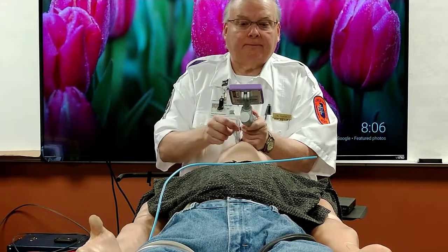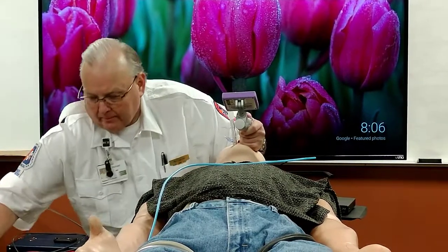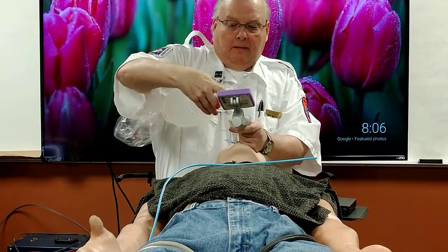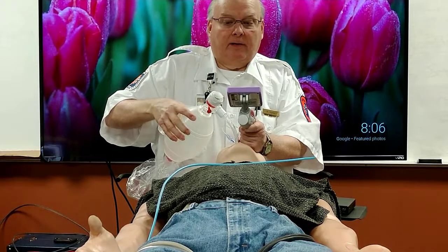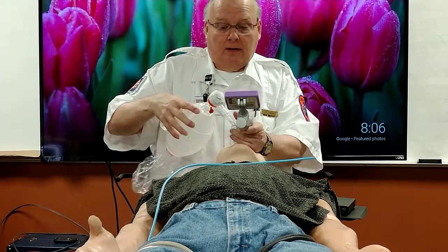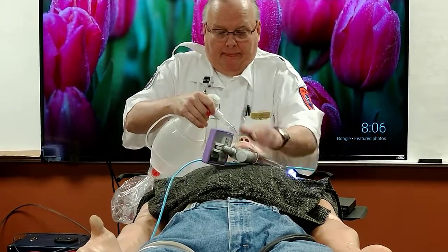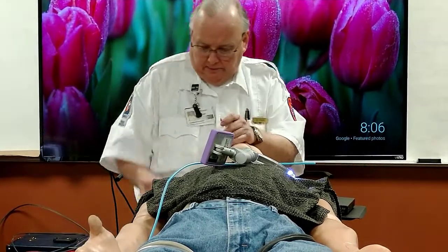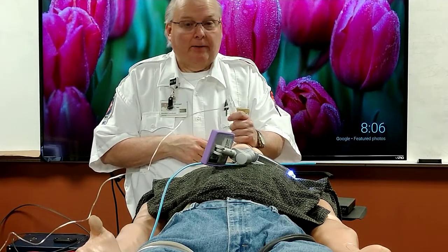Inflate the cuff, secure my tube, attach my bag mask, ventilate through that, checking lung sounds. Also, the next thing I would do is to obviously put the end-tidal CO2 on and then continue ventilating at that point.